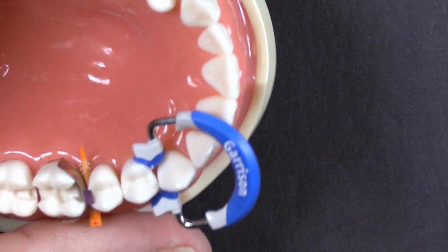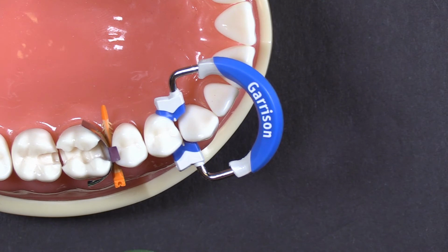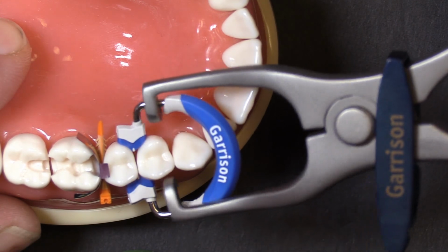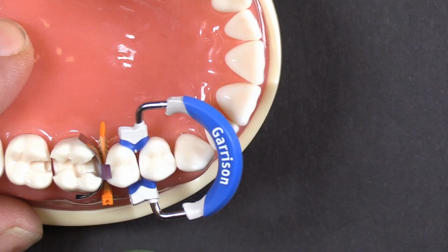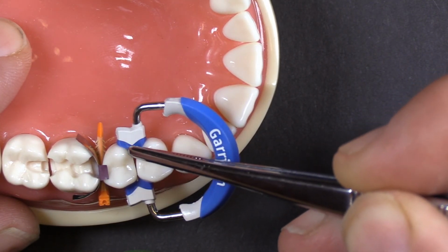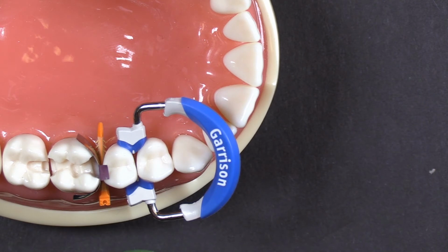Again, this was an offshoot question that somebody submitted: there are times where I'm getting really great adaptation on 3 of the 4 pads, but I've got one pad that's sticking way out. Well, they're designed for basically the law of averages. It's going to fit the average tooth. And there will be cases where the tooth is maybe malpositioned or twisted a little bit, where it doesn't get as perfect of an adaptation.